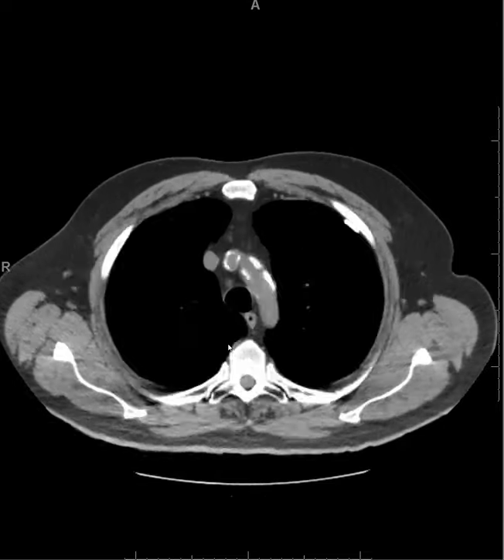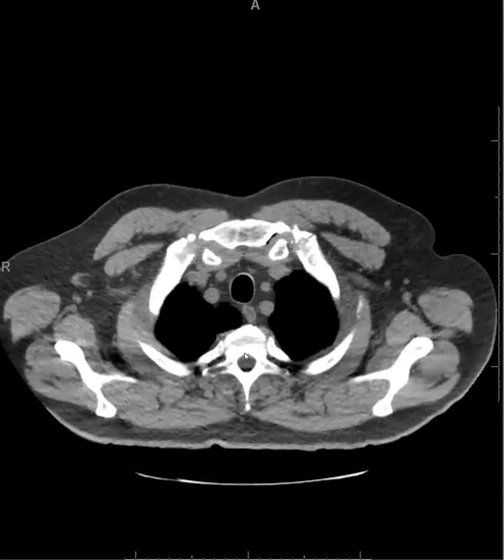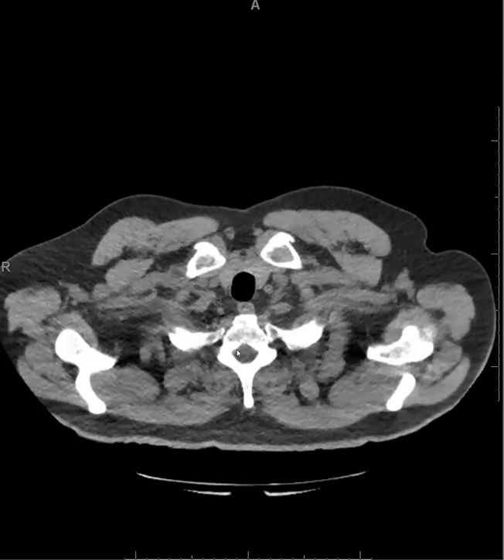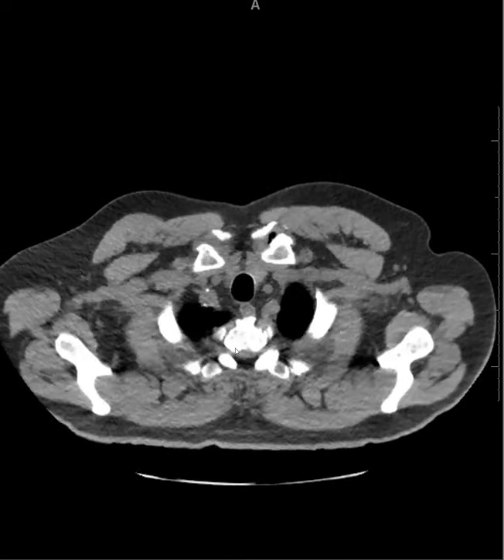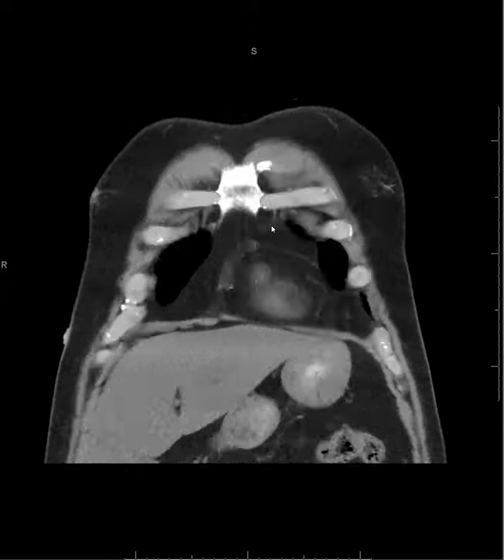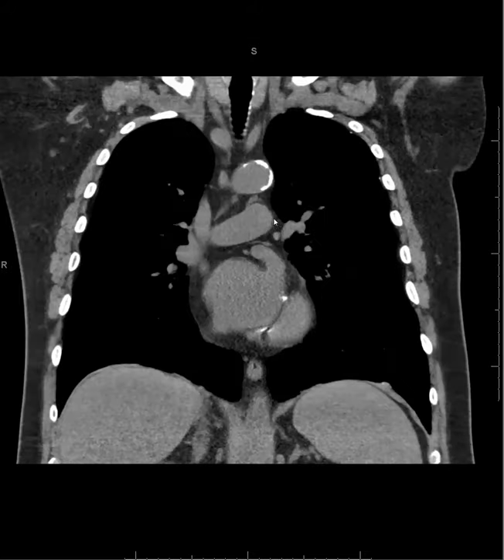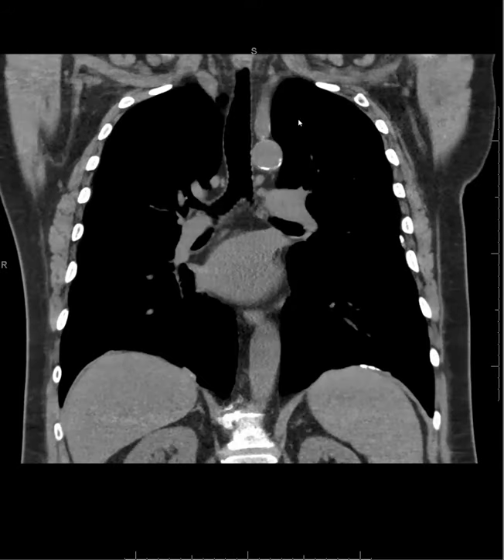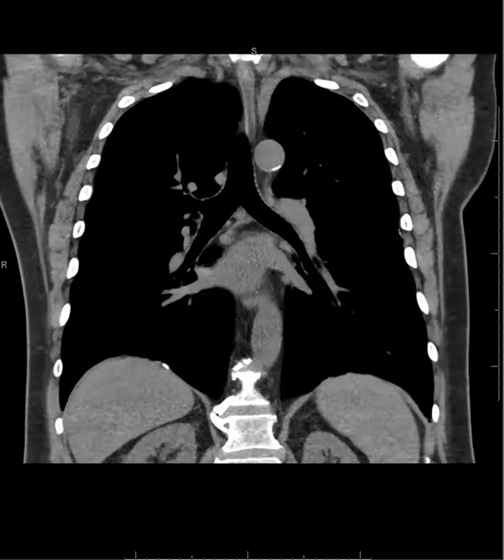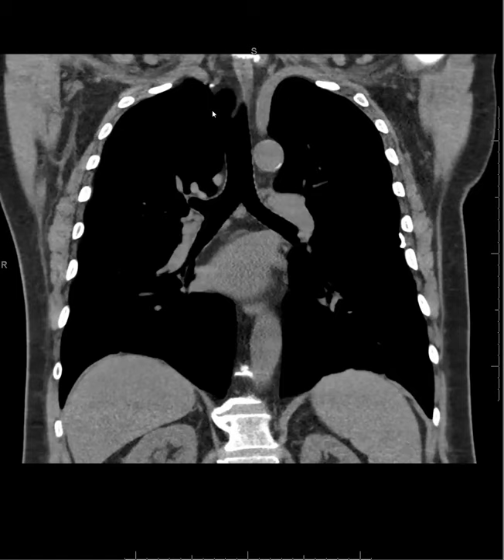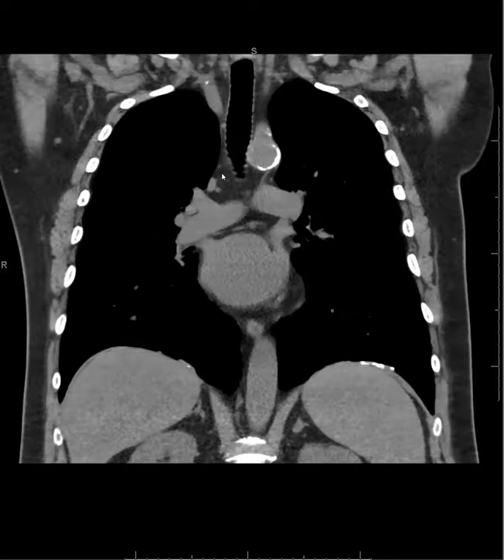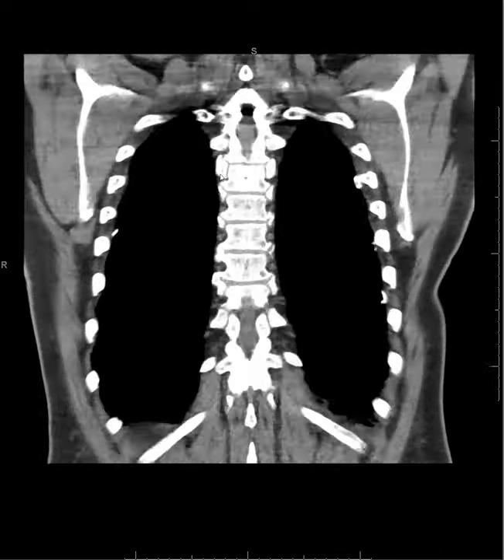One little pearl: asbestos-related pleural plaques nearly invariably spare the apices. You'll note that the apices really have nothing to speak of in regard to pleural disease. On the coronal reformation, that's not plaque — that's a little calcium within an artery.